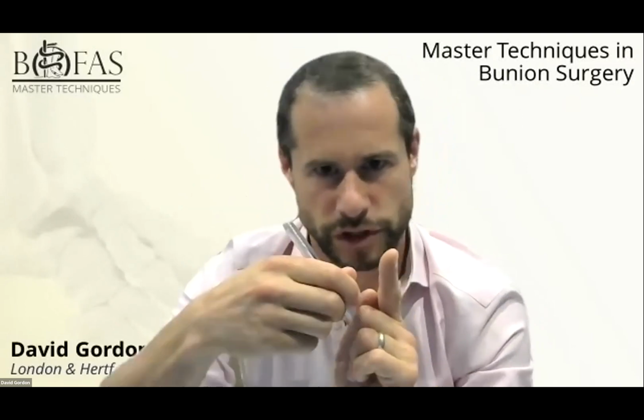But of course you're not, because you've shifted your head back. So you're effectively doing your pull technique, as you would describe in your scarf, when you're pulling that proximal metatarsal to open up that intermetatarsal angle even further. Then you do your translation and fixation. So I hope that explains it accurately, but that's what you're doing. You're locking out that first TMTJ, so it's not moving anymore.